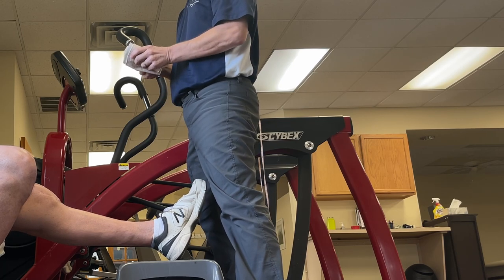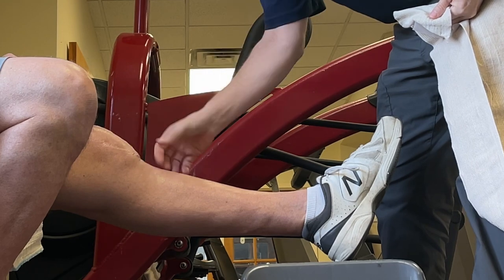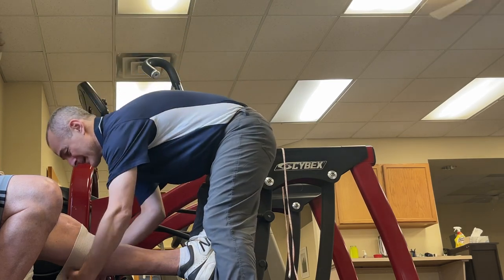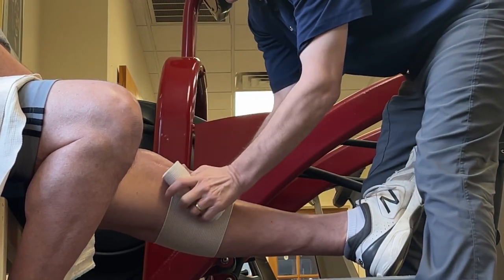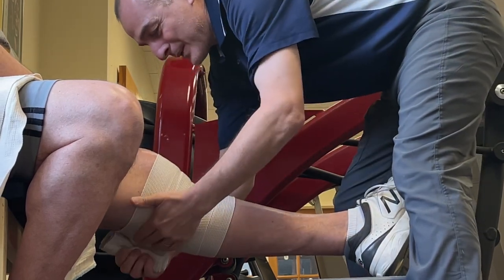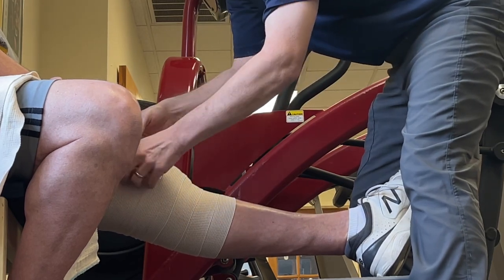We'll probably use them both because they're long enough. The ankle looks great. We're gonna focus right below — probably about four fingers below where the real pocket of swelling starts. No velcro, nothing on there — that's gonna be our anchor, so that goes on the bottom. Because we're doing this to reduce swelling, I'm wrapping it tighter than I normally would. If I was gonna leave this on for two or three hours I wouldn't wrap it nearly this tight. It's not painful, it's not uncomfortable, but it's tighter than normal because we're only going to have it on for about ten minutes.